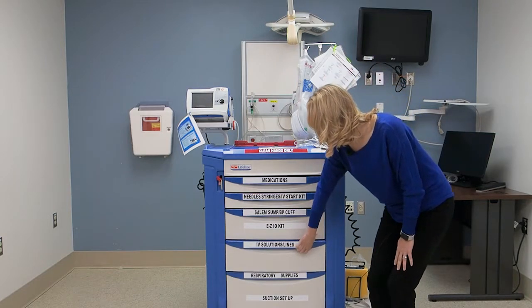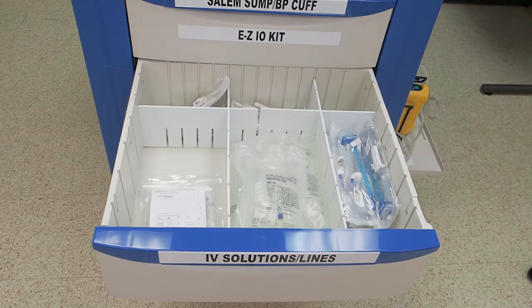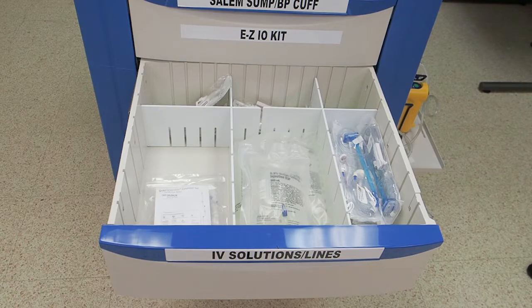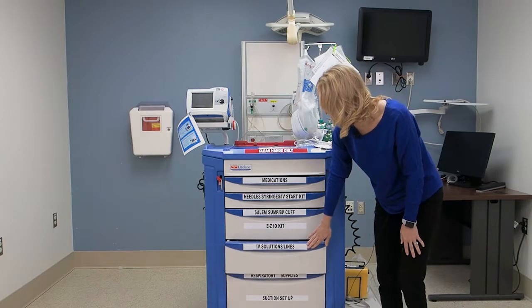The next drawer is going to be your IV solution drawer. And in this drawer, you'll have your IV solutions and any tubing that you would need, primary tubing, secondary tubing that you would need for patient use.